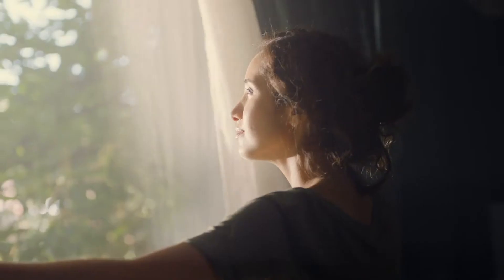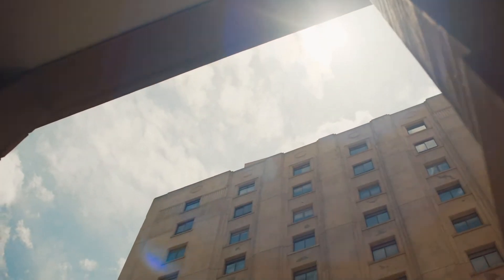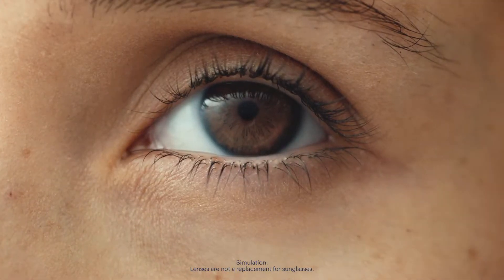This contact lens knows light. This lens knows what light you need and filters the light you don't. It changes from clear to dark, so you can squint less and see more.